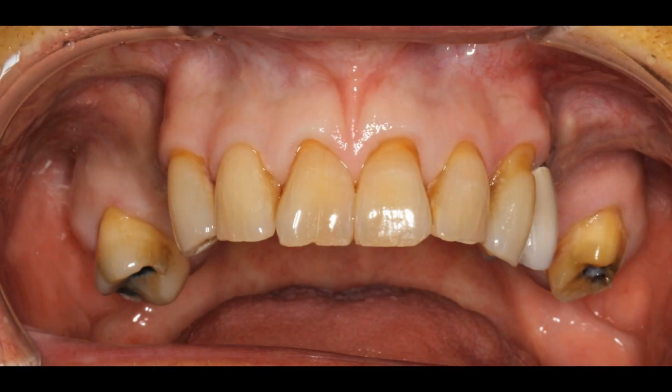Case 4. This patient presented with several good teeth. Well, I should say more than several. He had 8 good teeth. And like I described earlier in the video, when we do take out good teeth is a decision made by the patient and me at the treatment plan.